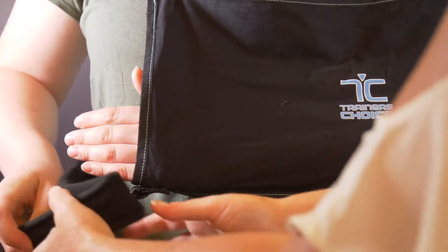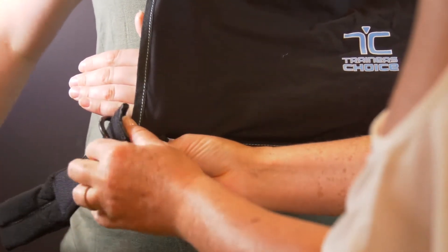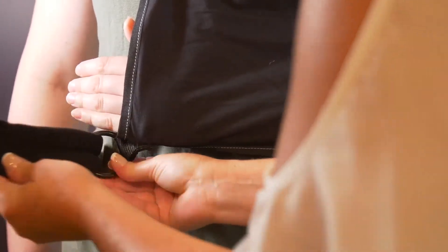Wrap the bottom strap behind the back around the waist, threading through the ring at the front of the sling and Velcro back on itself.